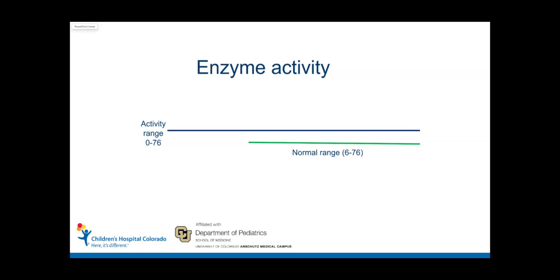And if we're looking at an enzyme that is associated with an MPS, we have a range that we note in patients with the condition. I think it's really important to know that that's not always 0. There's a little bit of room there on the bottom in what we consider to be the affected range. And the way this works in the textbooks is anybody who's a carrier is here. They're clearly separated, and it's really simple.